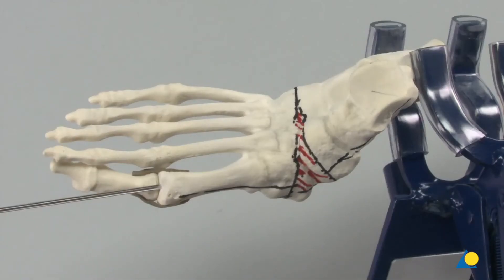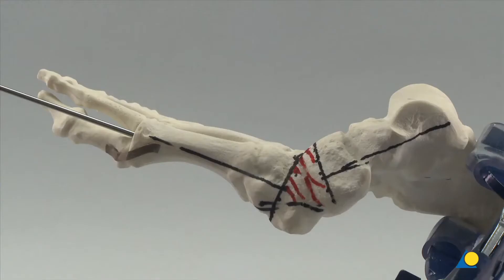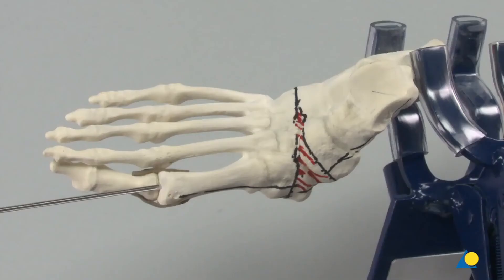The resection must be planned in the sagittal, transverse, and coronal planes to correct the deformities appropriately. This plantar and medial-based wedge will correct the rocker bottom and abduction deformities. The goal of the procedure is to provide functional reconstruction — to restore functional rather than normal anatomical alignment — so some shortening can occur.